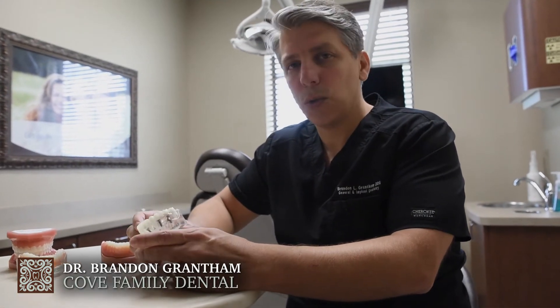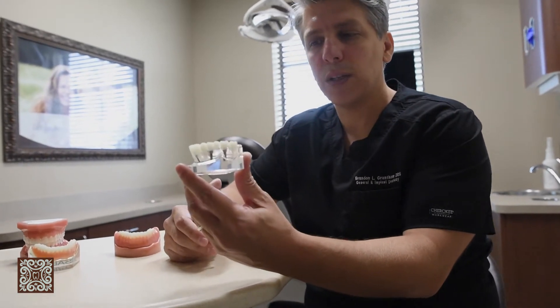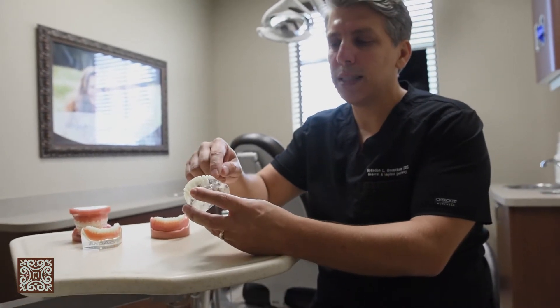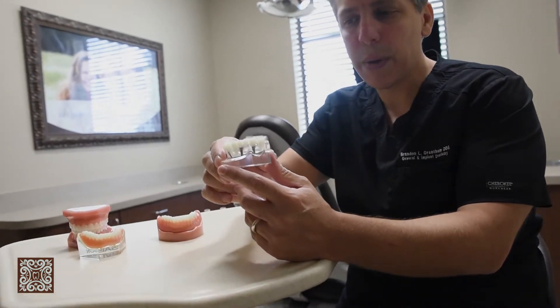These models are a few of our educational tools we use with patients. It shows exactly how implants work. We have the teeth, and anytime there's an extraction or a tooth gets pulled, we can replace that tooth with an implant — and this is actually what the implant will look like in the mouth.